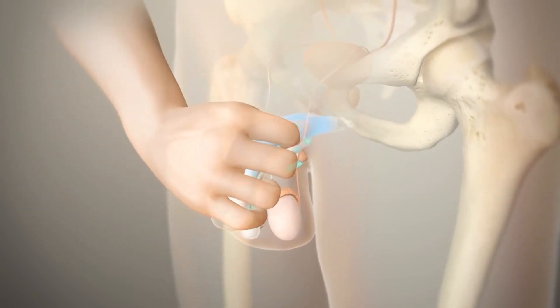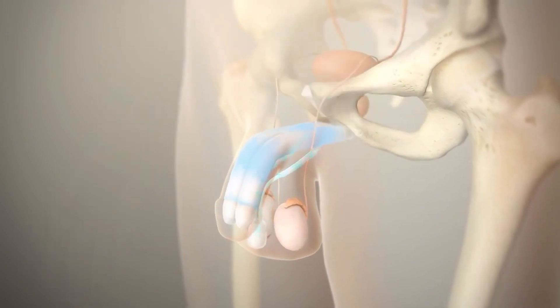When you're done and no longer interested, you push the button on the device. It releases the fluid and the device goes down.